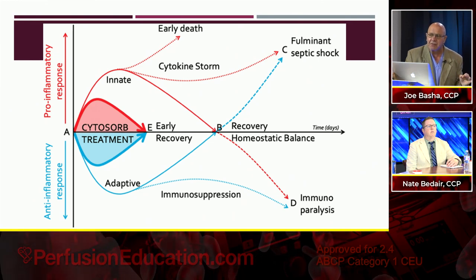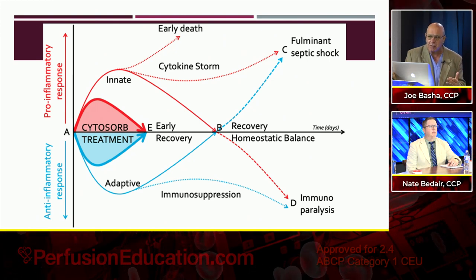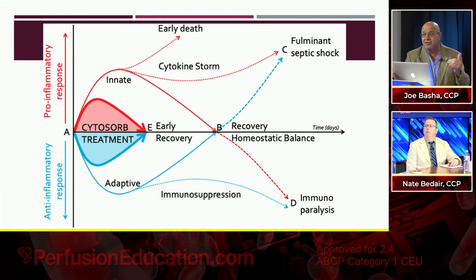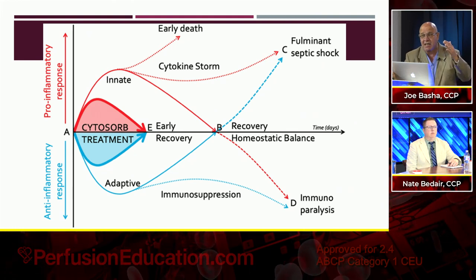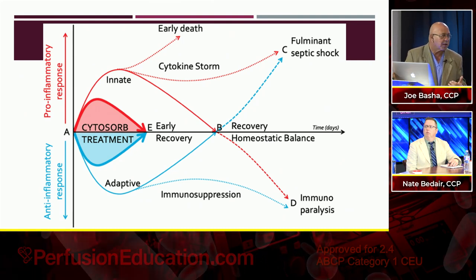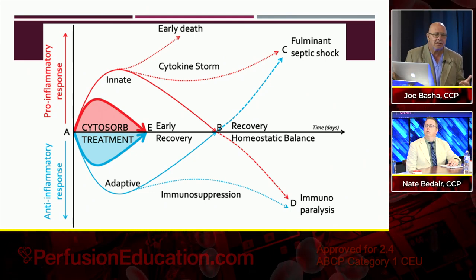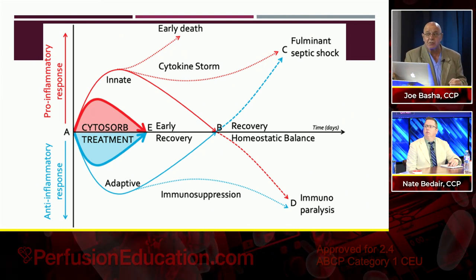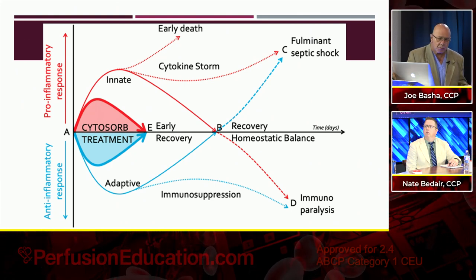But you'll see that when your innate and your adaptive immune systems get out of control, you have first a cytokine storm, which can lead to shock, but can also lead to essentially immunoparalysis, when you have just been in a cytokine storm and then everything just drops to zero. Either direction, you're going to be in a lot of trouble. CytoSorb clears those inflammatory mediators much more effectively than you can with CVVH. I think CVVH, if done with high dose, can be beneficial, but not nearly as quickly as you can do this.